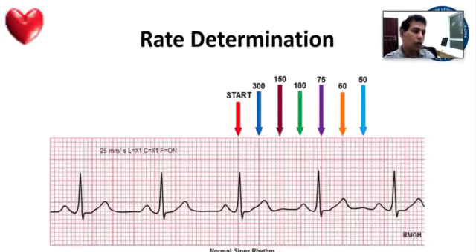Now, when you interpret an ECG, one important thing is for you to identify the heart rate. Oftentimes, the heart rate is printed on the ECG in the machine interpretation. I don't normally encourage young doctors to look at the machine interpretation because that is often wrong. These machine interpretations are there for paramedics, in other countries volunteers who go in ambulances as voluntary work.